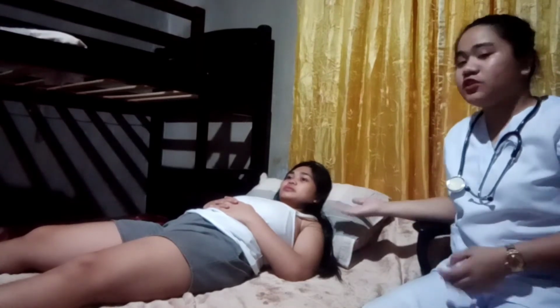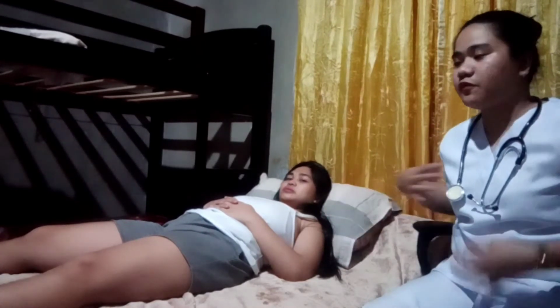Next, I will auscultate the apical pulse while she is in supine position for one full minute.